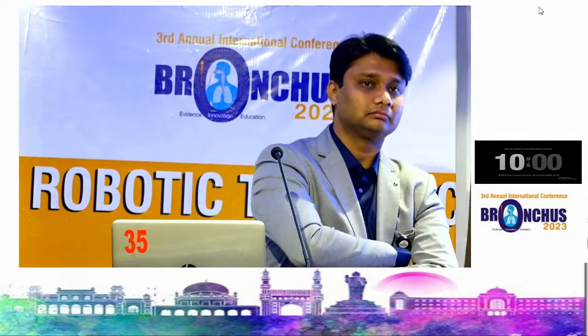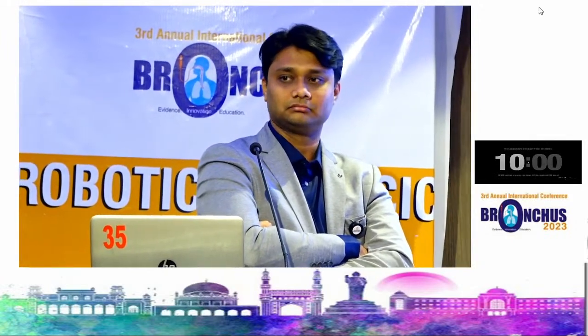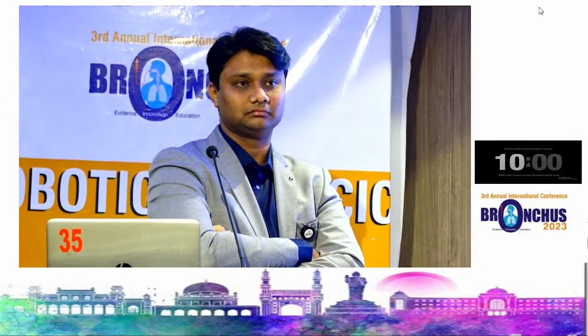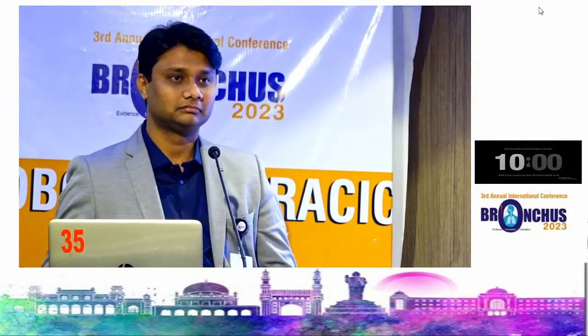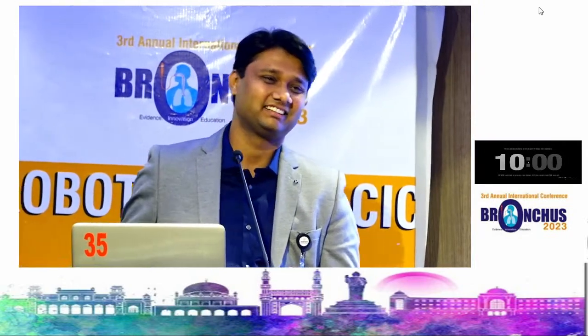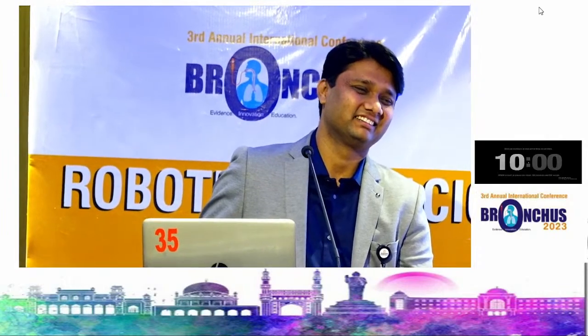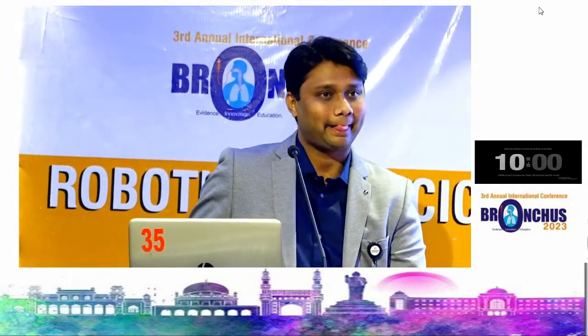Yes, I had one instance, my first uniportal left upper lobectomy. It was a tiring day, the staplers were less, and I had to suture all the pulmonary vessels and then divide. My assistant was a staff nurse. I am not privileged to get good doctors or staff nurses to assist me. He had put the Maryland into the left upper lobe and it hit the pulmonary artery, and the lobe became big in size. That is also possible if you don't have a trained assistant.